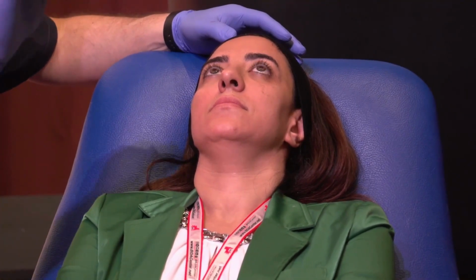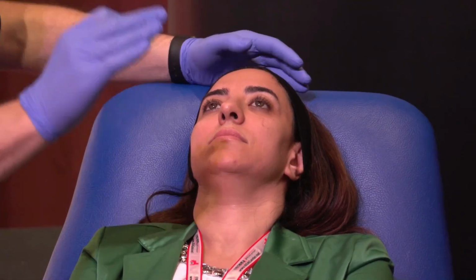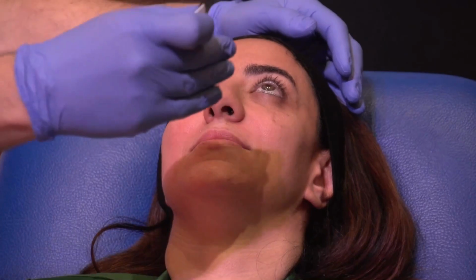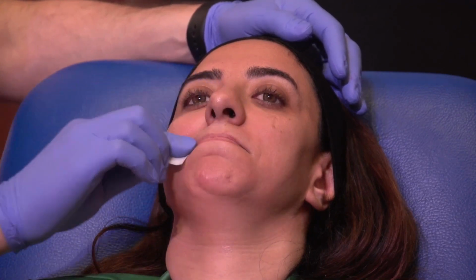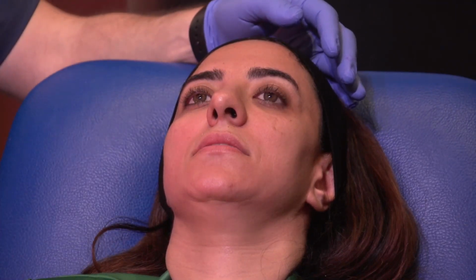So even after the nurses sterilize the mouth or the lips, I usually do it myself because what she's done is perfect, and maybe the technique that her surgeon or dermatologist does is a bit different than mine. So what she did is this, right? That sterilized the outside of the mouth. It did not sterilize where I will inject in my technique.